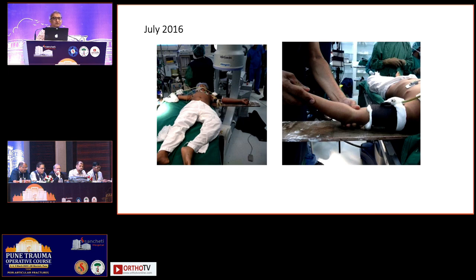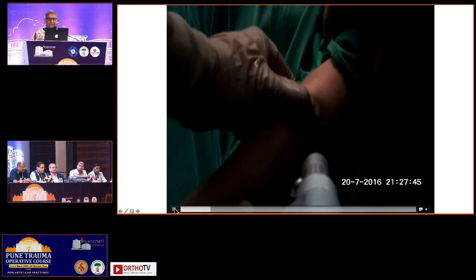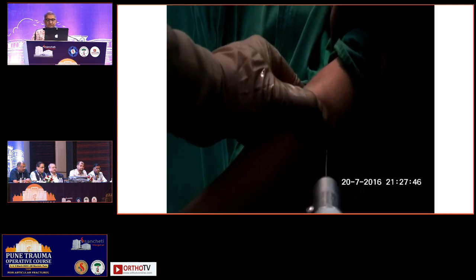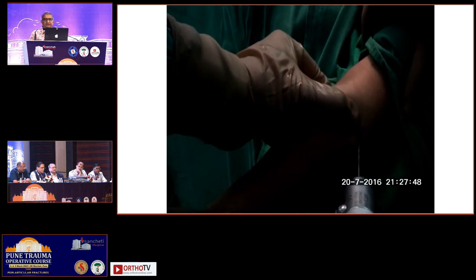I am also board certified, Sandeep. Use an arm board. Again, both of us do a lot of things similar. This is 2016. An arm board is used to position the patient, and a tourniquet is used. And this is how you would do the arthrogram. Playing this video. So first, put a temporary K-wire and then do the arthrogram.